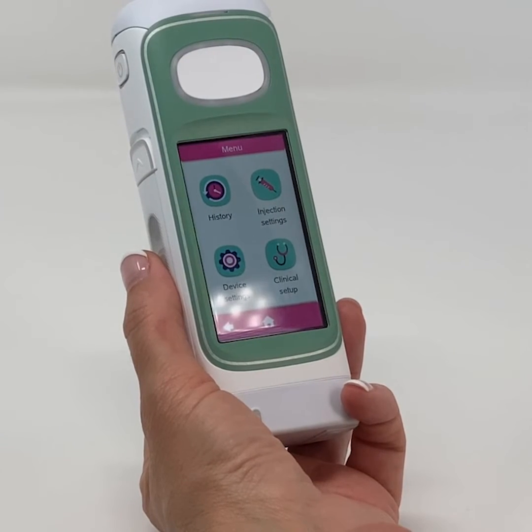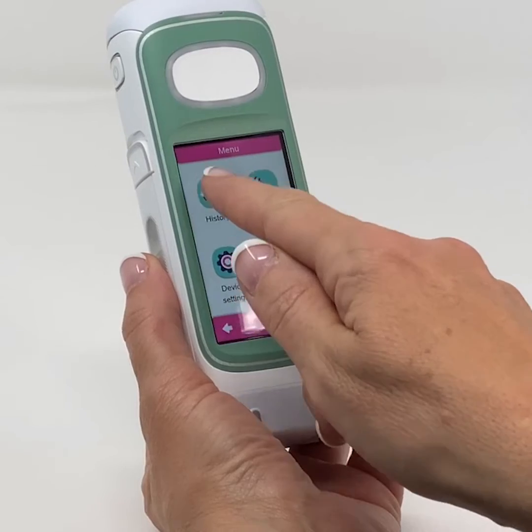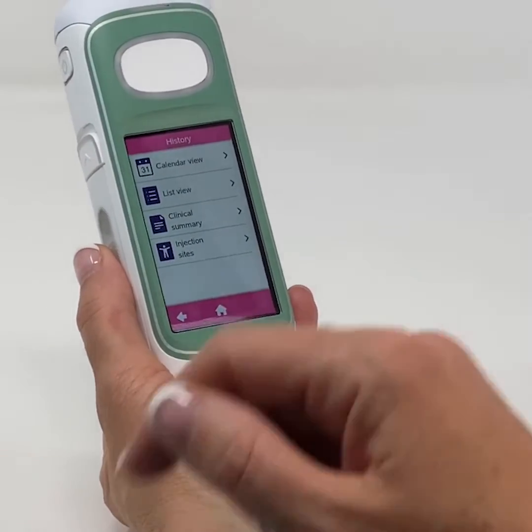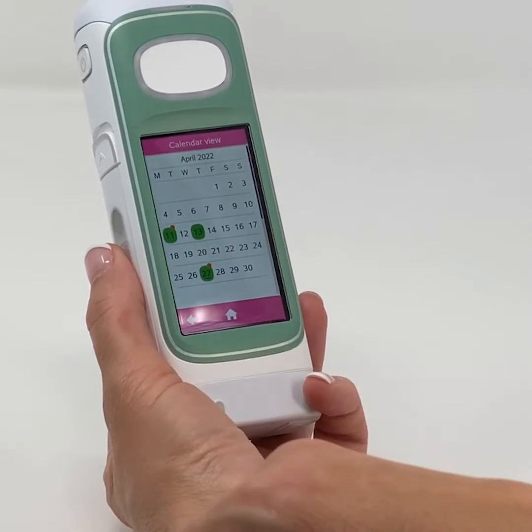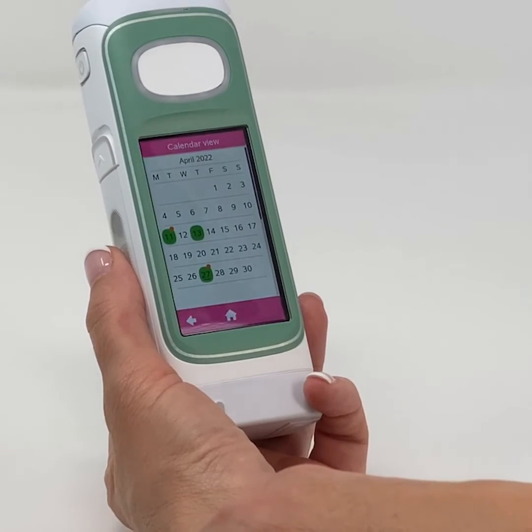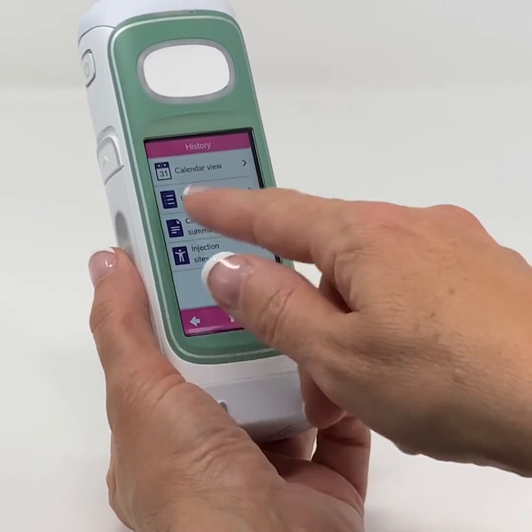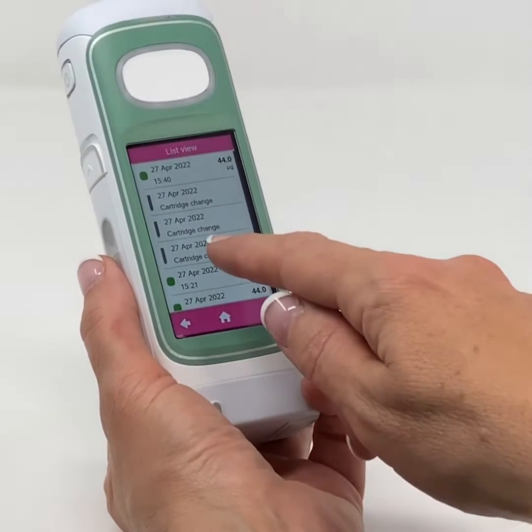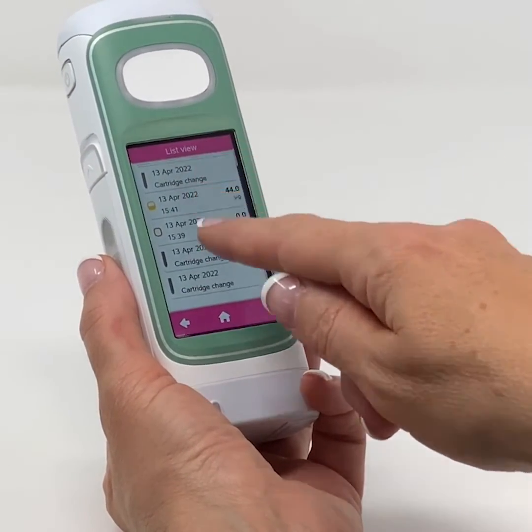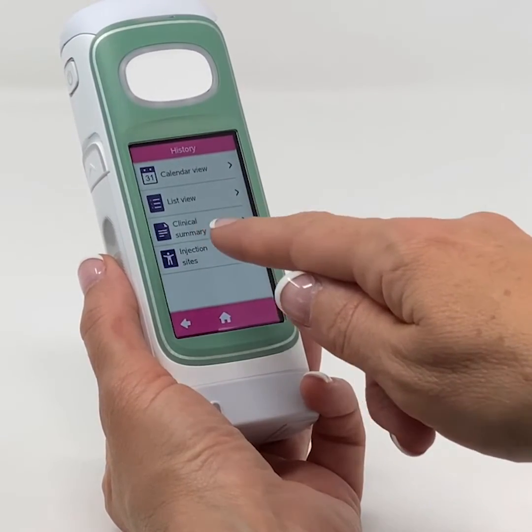From the menu options, you can view the history. There is a calendar view where each injection is marked, and partial or missed injections are also indicated. There is also a list view where each injection with date and time is indicated. There is also a clinical summary available.